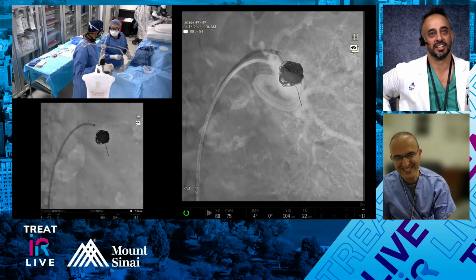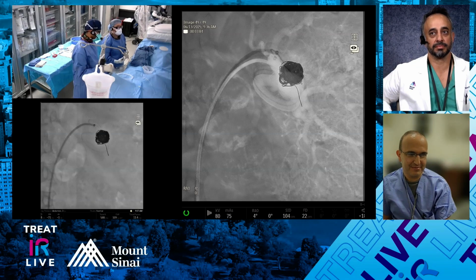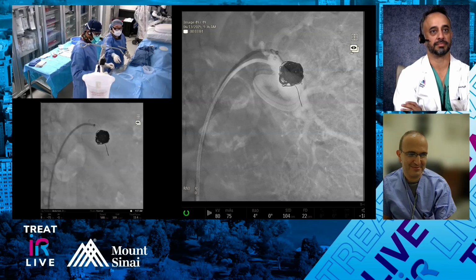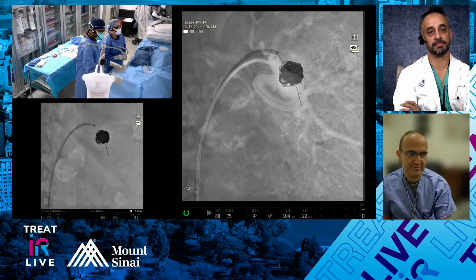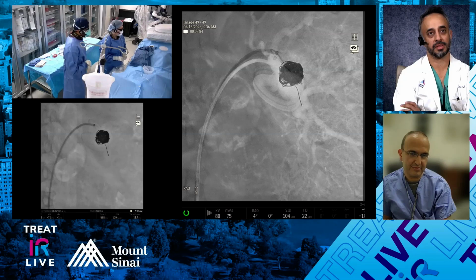Here's food for thought. Can we get forward on the side flush, please? Just for like 2 seconds, and then stop. Sometimes we deal with really large aneurysms. I mean, insane aneurysms, whether it's in the portal system or someplace else. Let's say 30 millimeters or, God forbid, 40 millimeters. What do you guys use for that?